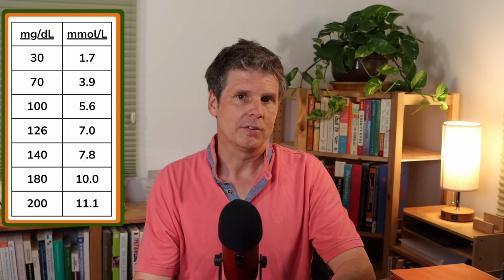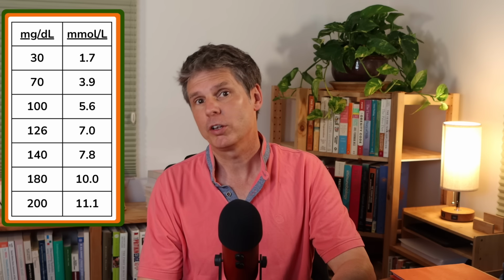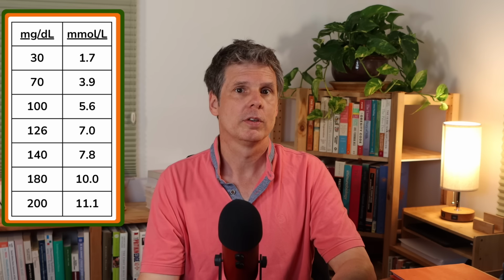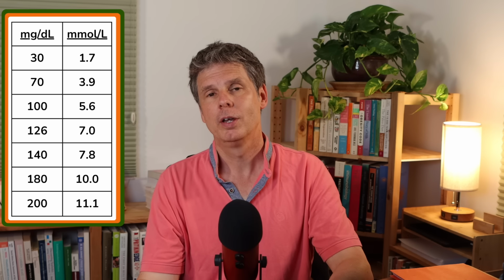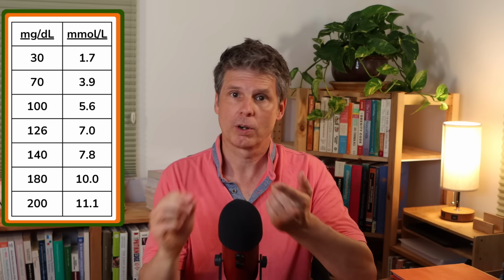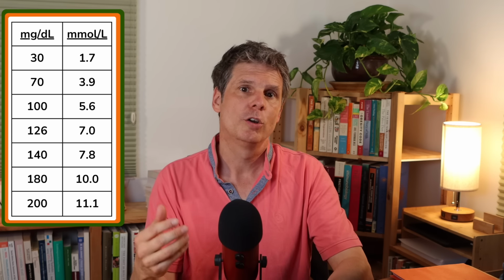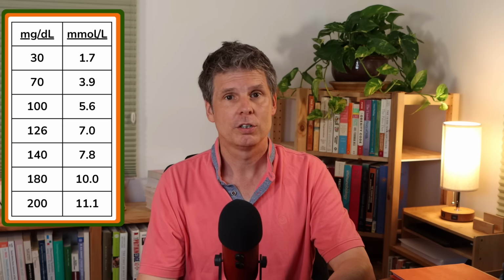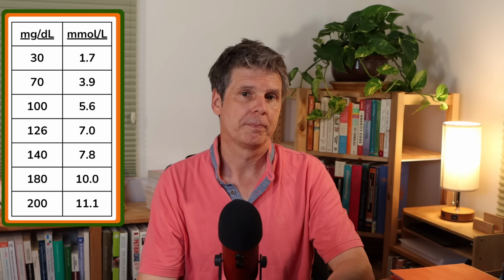One word of caution, however. If you lie on your CGM sensor at night, it can show very low glucose levels, not because you actually have hypoglycemia, but because of the pressure on your sensor. And CGM sensors can also be faulty every once in a while and show incorrectly low glucose levels. It may be prudent to have a handheld glucose meter available, the one that requires finger pricking to get a drop of blood, so that you can check your actual blood glucose concentrations if you ever have any weird or extreme glucose readings on your CGM.